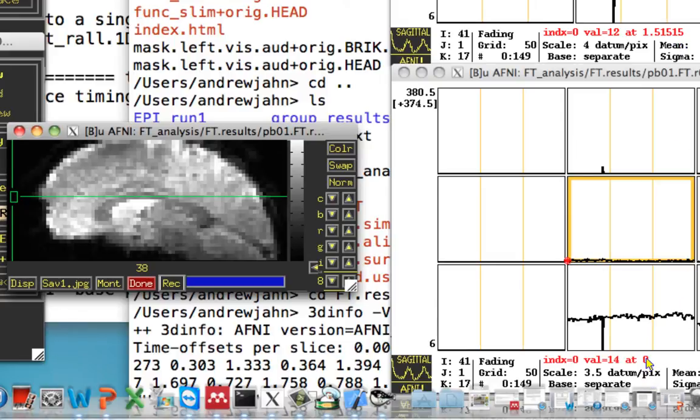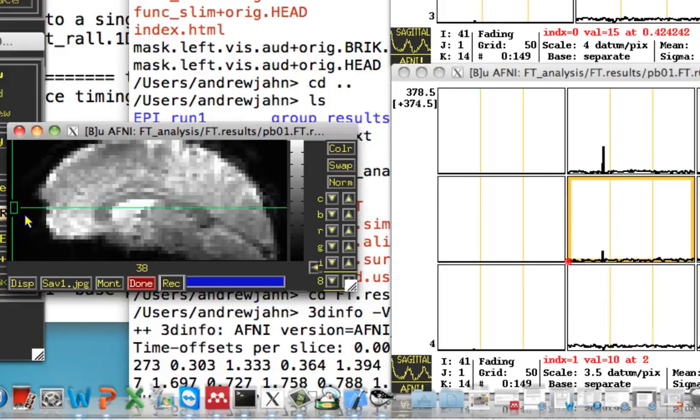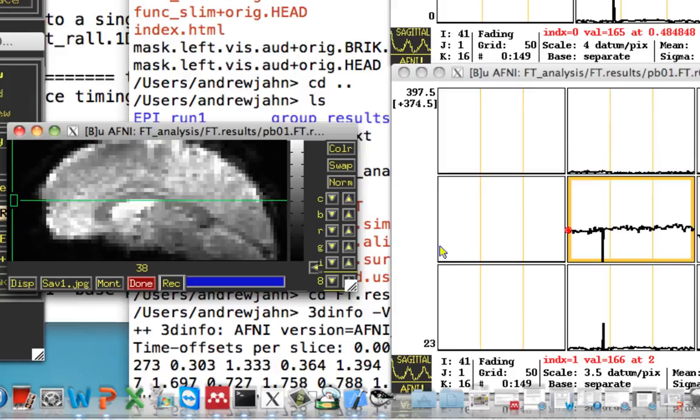But here, it remains 0. If I go and advance one time point, and I keep going through the slices up and down, that remains constant. That's the effect of slice time correction.